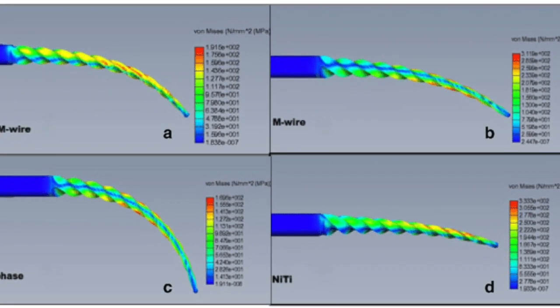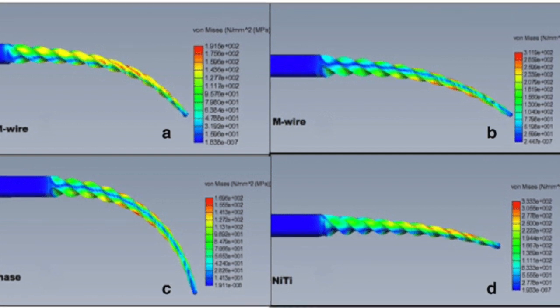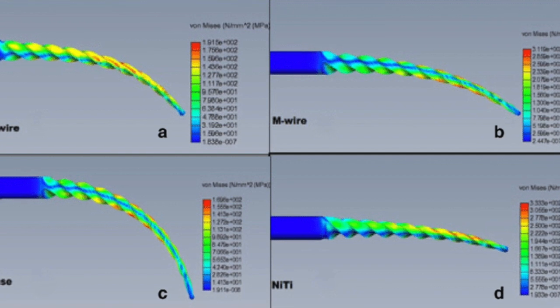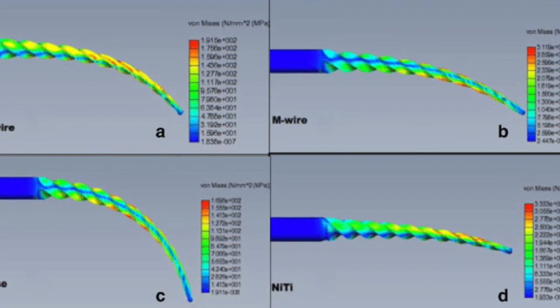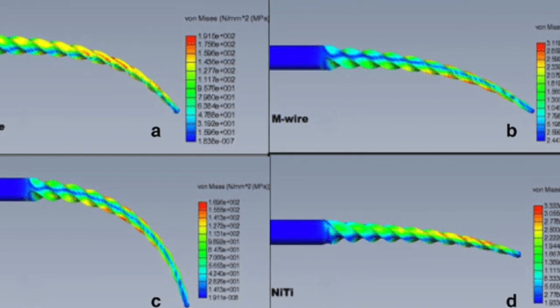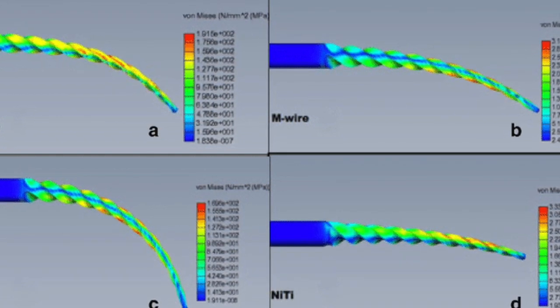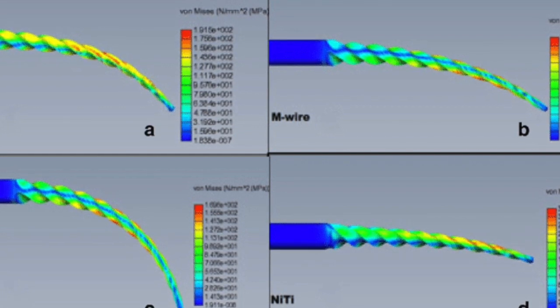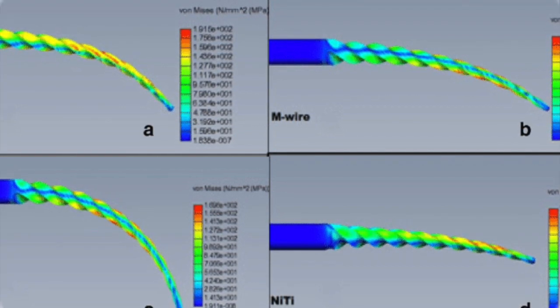Almost every nickel-titanium alloy used in root canal treatment contains approximately 56% nickel and 44% titanium. The resultant combination is a 1-to-1 atomic ratio of the major components, and similar to other metallic systems, the alloy can exist in various crystallographic forms.